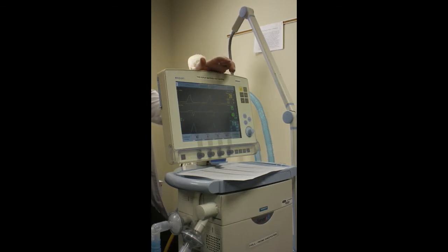So if our volume is off, it's going to affect our minute ventilation. If our minute ventilation is bad, what's going to happen to our ABGs? Acidic. Okay, and what's going to happen to our CO2? It's going to go up because we're affecting our patient's ventilation. Oxygen may or may not, depending on how your patient's status is, but it's going to affect the ventilation.